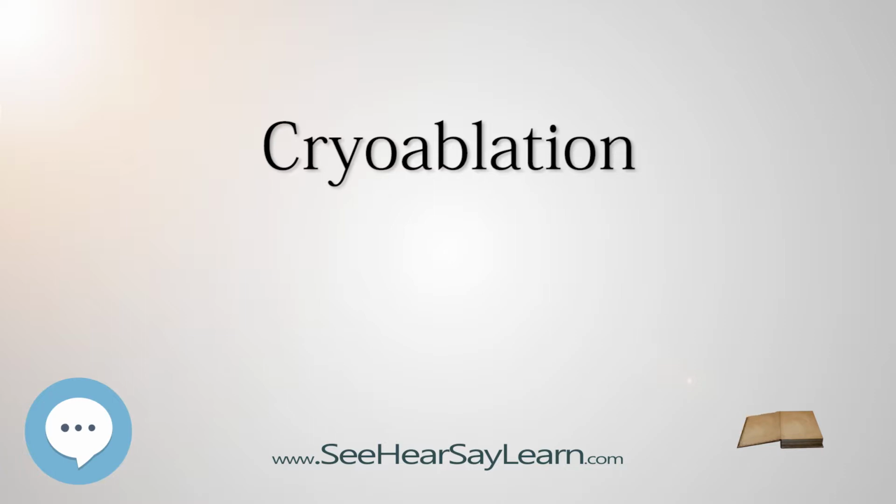Cryoablation. Cold temperatures are used in cryoablation to chill or freeze cells that conduct abnormal heart rhythms. The catheter removes heat from the tissue to cool it to temperatures as low as -75 degrees Celsius. This causes localized scarring, which cuts undesired conduction paths.